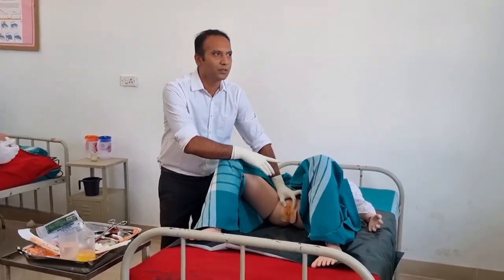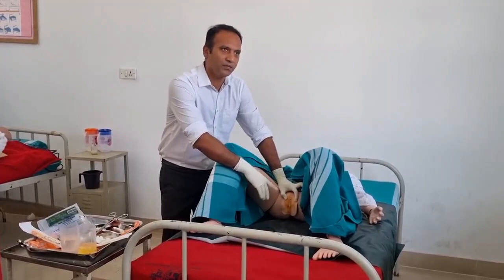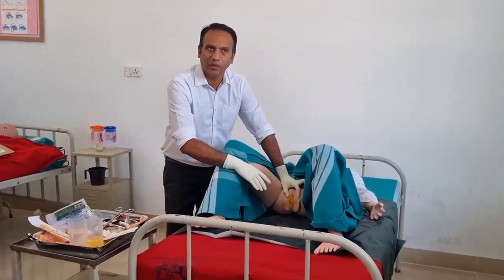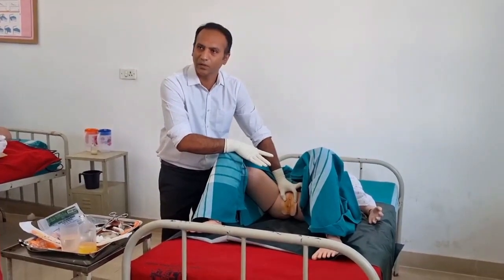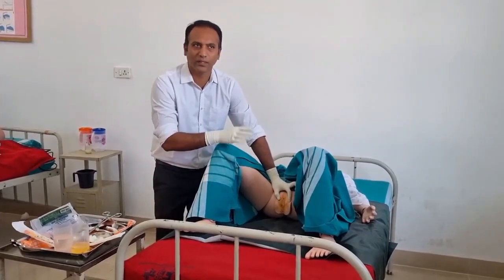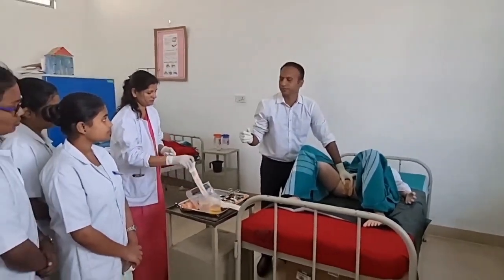Then the vaginal area or periphery of the vagina. Finally, from vagina to rectum. You are going to repeat. First I did it with betadine, you are going to repeat it with saline. So assuming that we have completed the process, now I will ask the madam to give me the catheter.